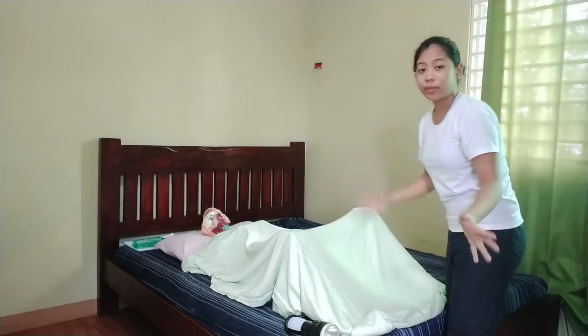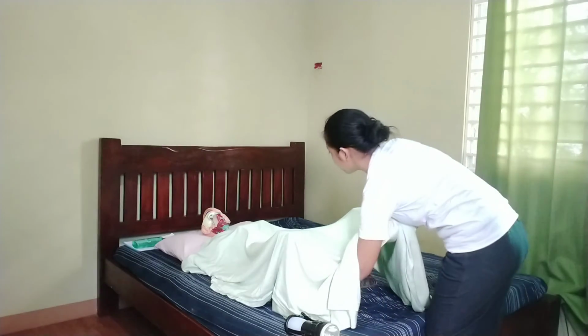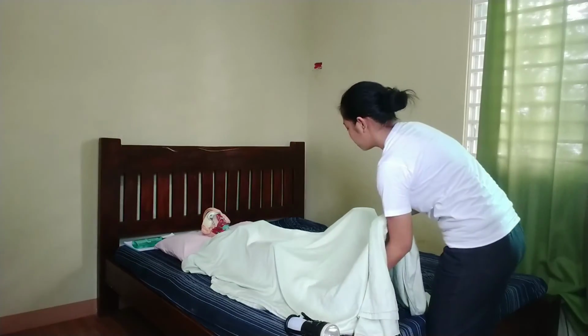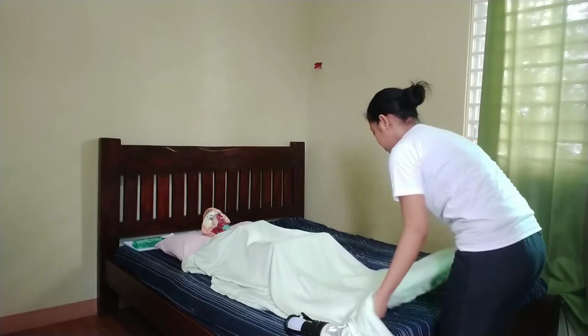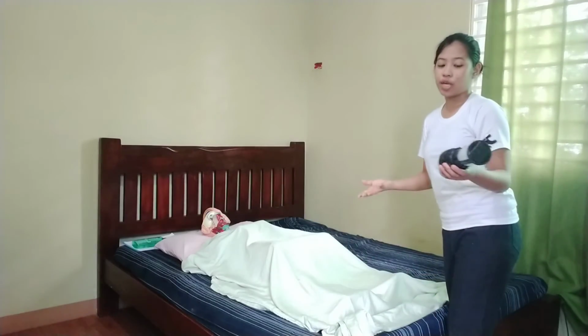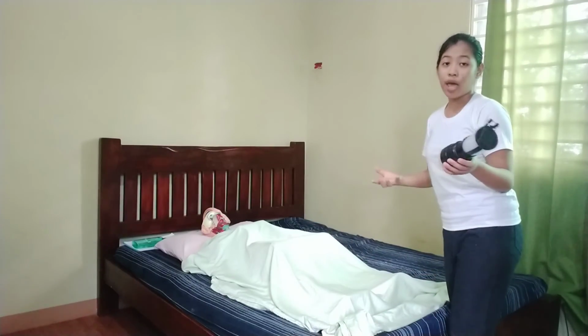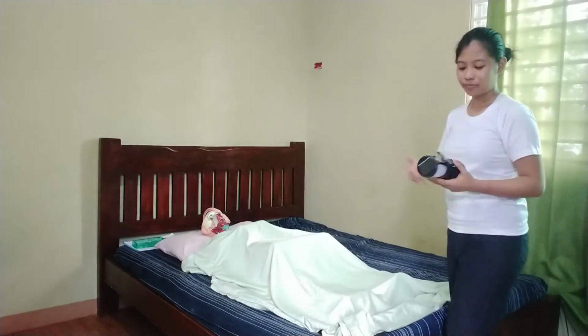So I will now reposition my client in a comfortable position. Let me put you in a comfortable position, ma'am. Thank you. After that, I will check whether the Perilite lamp or any equipment is working properly. So it's working.